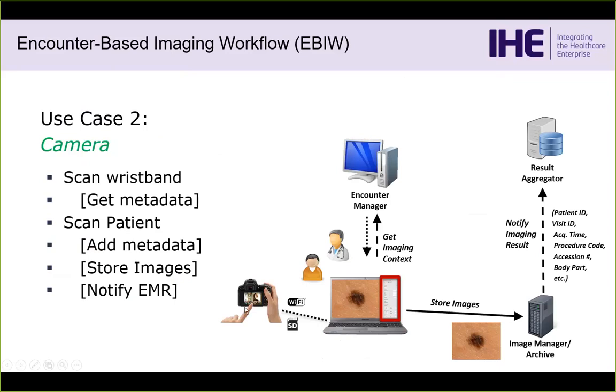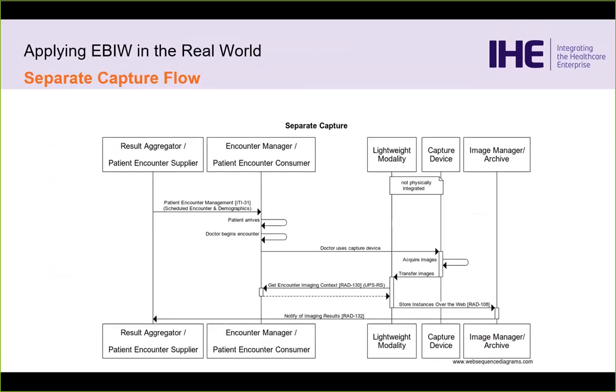So in the same way, your capture device, whether it's an SLR or whether it's a dumb smartphone, for example, software deals with how it's going to get the images off it. Might use Wi-Fi, might be put the SD card over, but it's the software then that queries for the metadata and stores it out into the infrastructure.